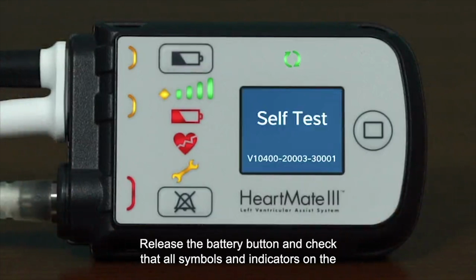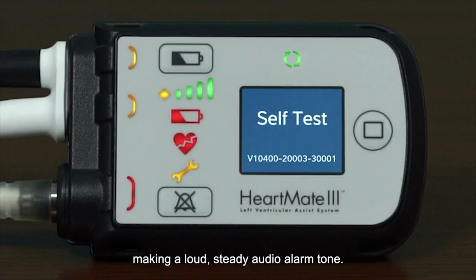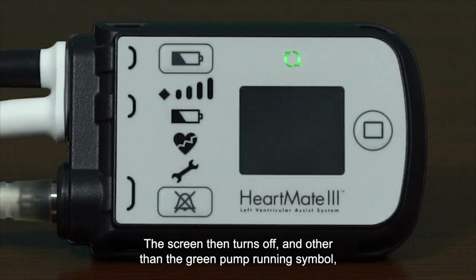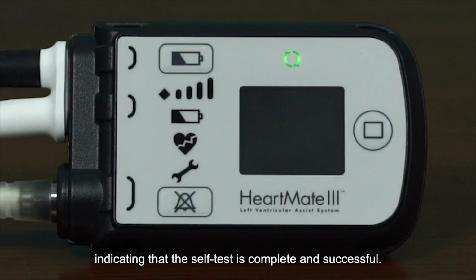Release the battery button and check that all symbols and indicators on the front of the controller illuminate at the same time, and that the controller is making a loud, steady audio alarm tone. All the lights, symbols, and sounds should remain on for a total of 15 seconds. The screen then turns off, and other than the green pump running symbol, all the lights, symbols, and sounds turn off or stop, indicating that the self-test is complete and successful.